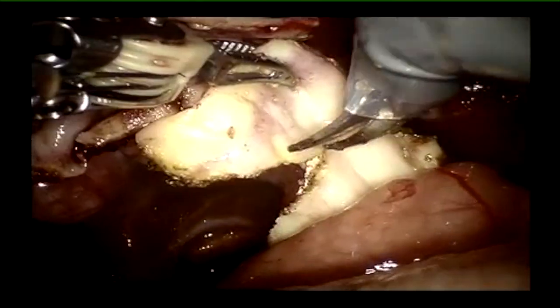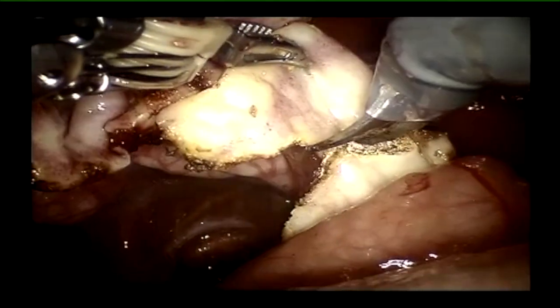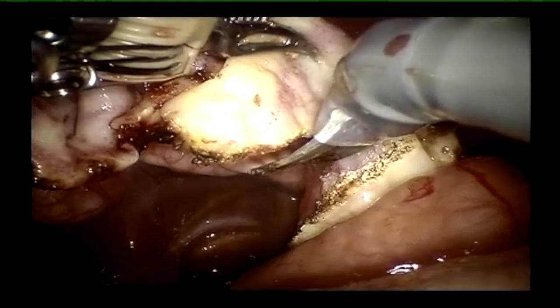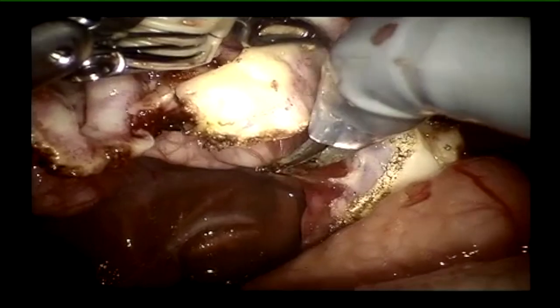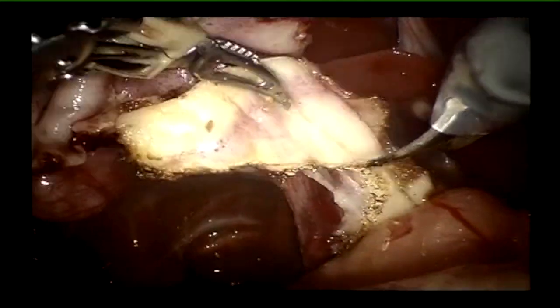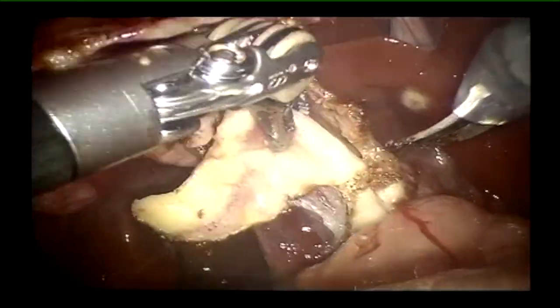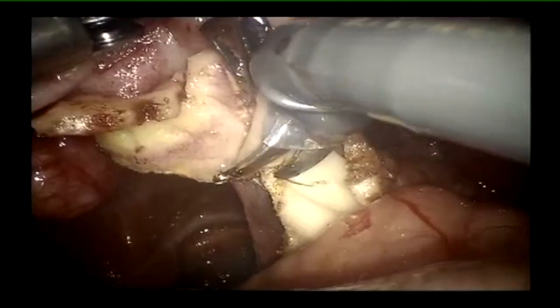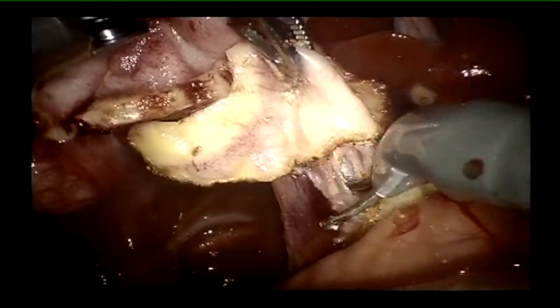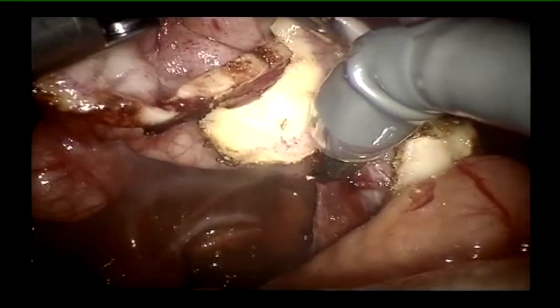To minimize the risk of future carcinoma developing from any remnant, we burn away the mucosa at the end of the cyst dissection. We always keep these patients on follow-up — at least for five years initially, then a follow-up every decade, maintaining long-term surveillance.